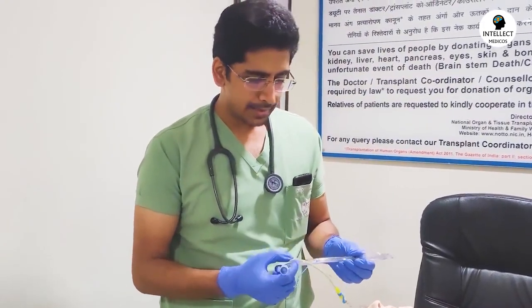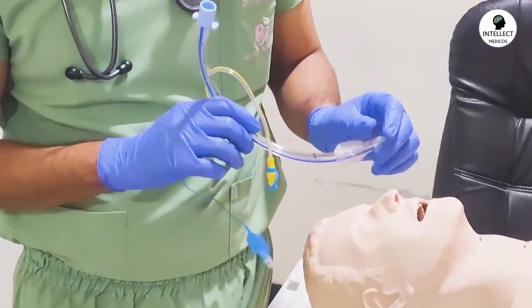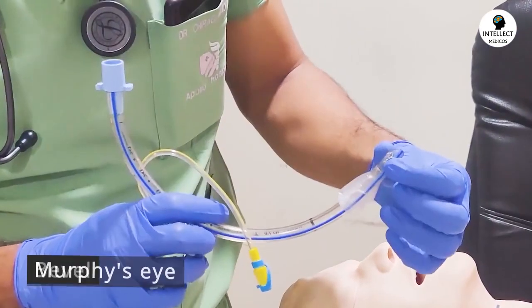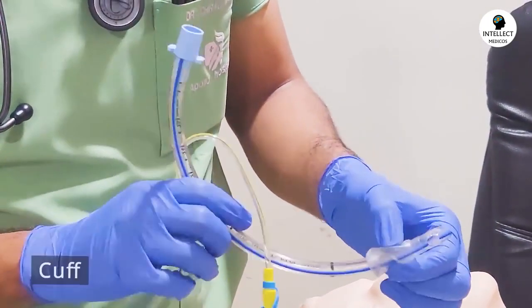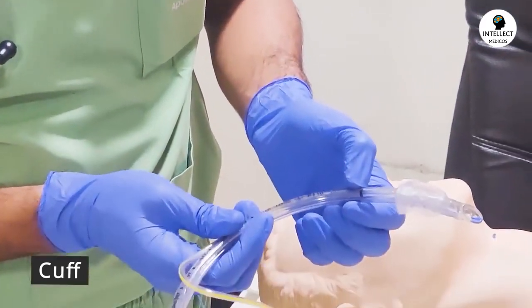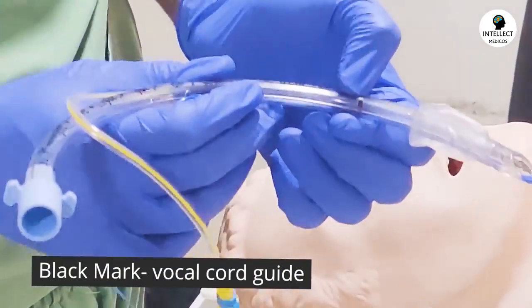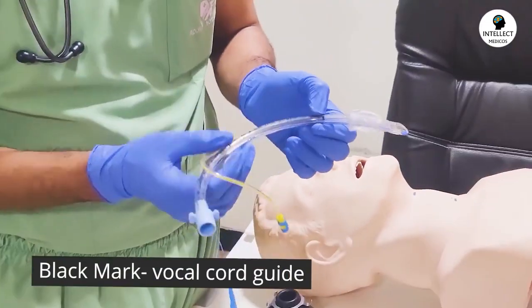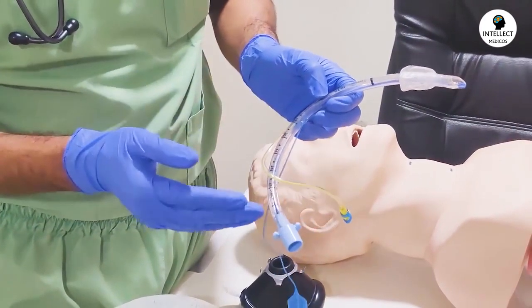Now the parts of this endotracheal tube, starting from here: this is the bevel having a Murphy's eye, so as to act as an adventitious port. This is the cuff of the endotracheal tube. Then there is a mark over here. This black mark should ideally cross the vocal cord while you are intubating a patient. And there are various marks over here so as to see the depth.